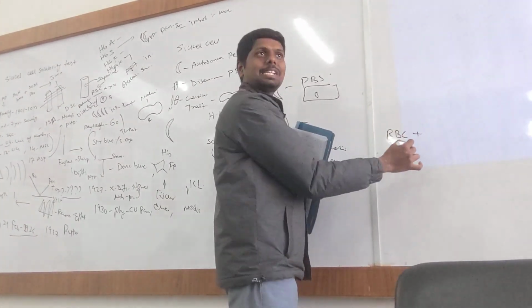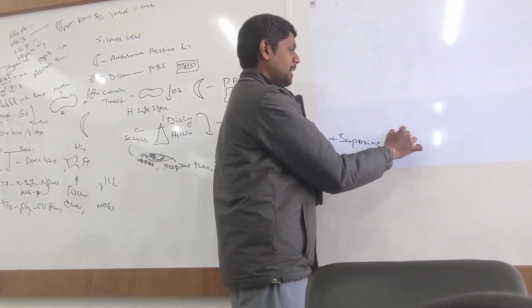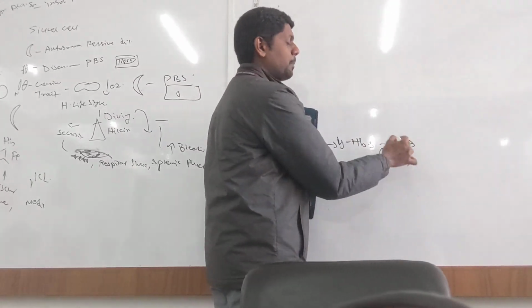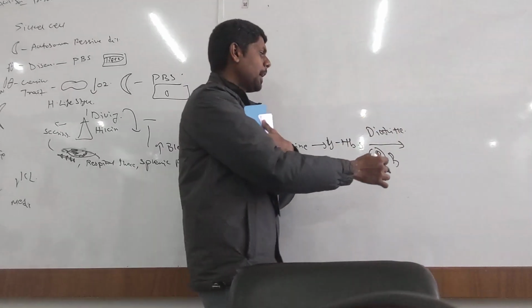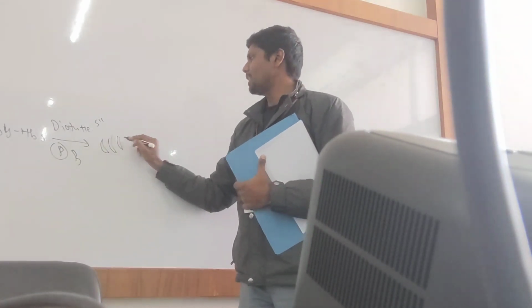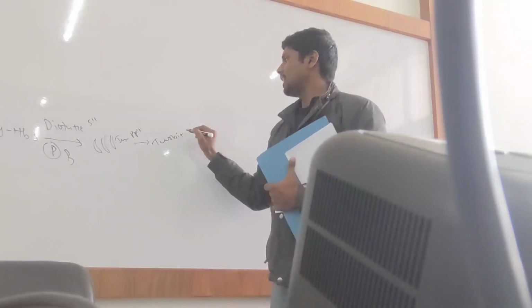Red blood cells plus I added saponin. What did it do? It lysed the RBCs and released the HbS. Now the released HbS is subjected to phosphate buffer plus dithionite. In the presence of dithionite, in 5 minutes, it made insoluble precipitates. These insoluble precipitates are turbid in nature.